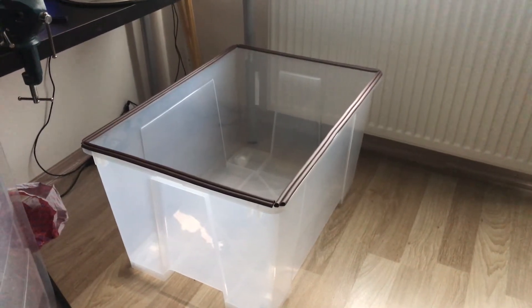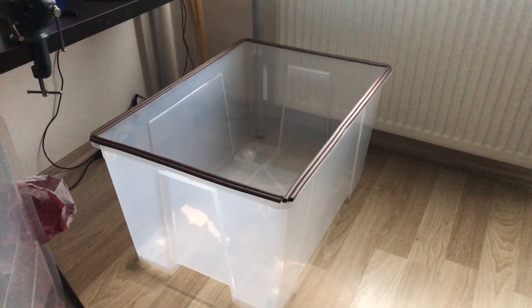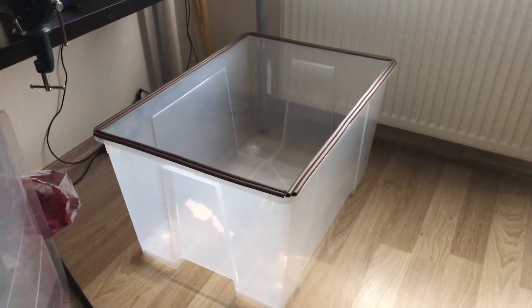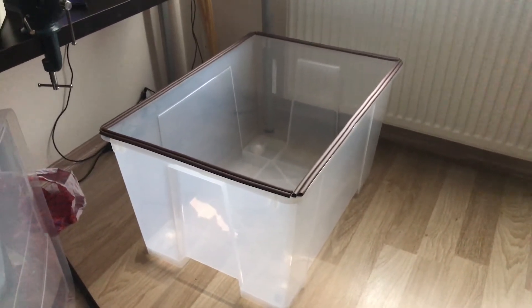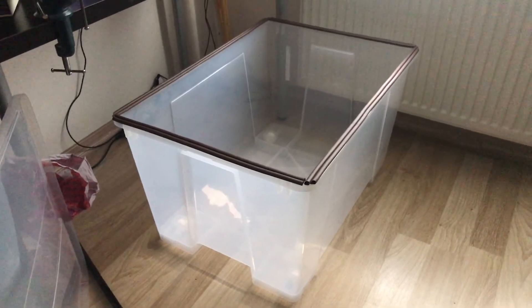Hello everyone, today I'm going to build a nebulizer enclosure for my sick cat because you can't put a nebulizer mask on a cat and I have to get him some inhaled medicine somehow, and this seems to be the only solution.